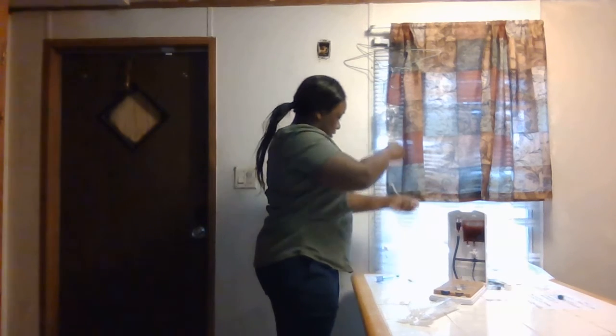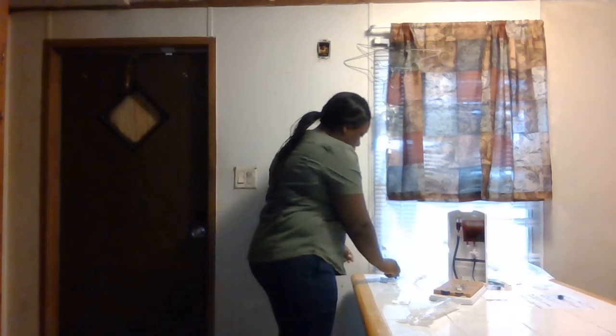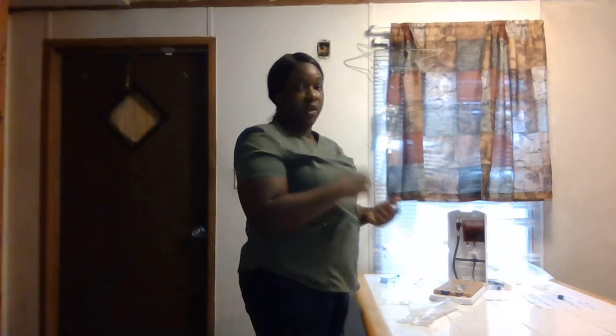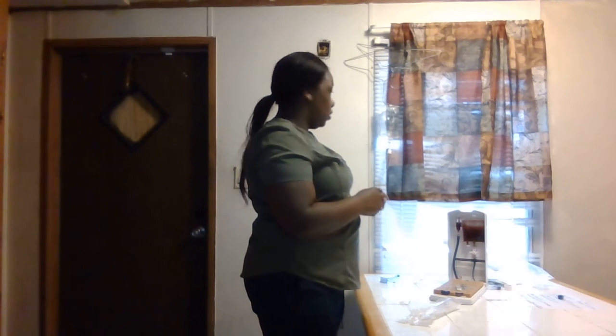All right, and I'm going to sit this here. It would have been lying on my patient. And again, we're going to label this tubing with the date and the time. Okay, and again, always wash your hands, removing gloves, wash your hands, those post-procedural things.